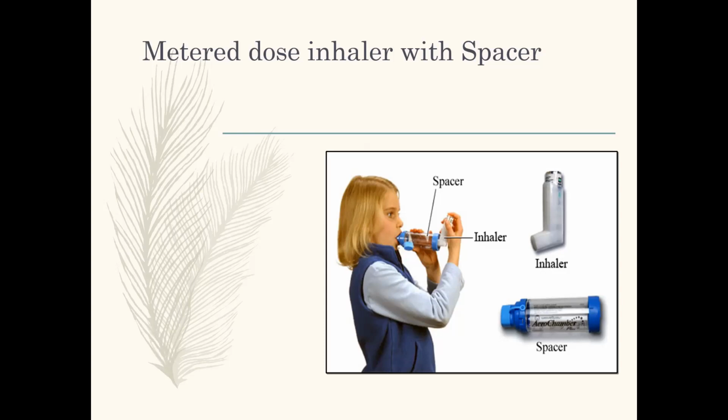Some home considerations. Many times clients in the past would what they would call float their inhaler. They put their metered dose inhaler down in water to see, hey, if it floats, it's still got stuff in it. Or if it sinks, oh, it's empty. That is not a recommended standard of care.